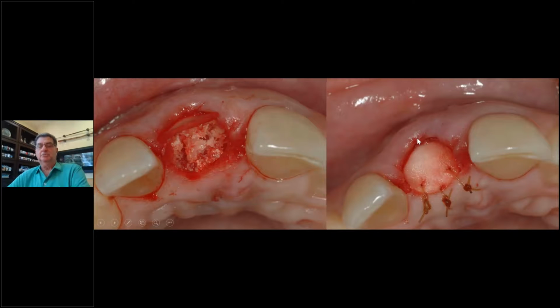And this is what a lot of people don't realize. You can push the graft out. See, right up in here. Push it out because the bone is gone. So notice it's almost distended out because I will get a little bit of shape in. So I want to almost push it out. And then I use some fast-resorbing sutures, chromic, and that's all I do.